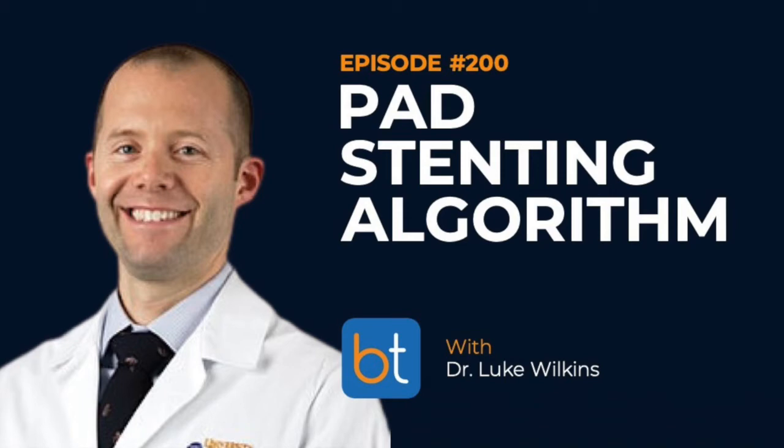Can I clarify something, Luke, real quick? So you're saying that significant disease less than 10 centimeters, if there's not any, you just do PTA. But if it's more than 10 centimeters, then we do atherectomy plus PTA. Am I reading that right? No, you're not reading that right. Sorry, that's like a double negative or double positive. If there's significant disease that's less than 10 centimeters, then do atherectomy and PTA. If not, I'll just go PTA. And if it looks good, then I'll DCB it. I see. Okay. You know what I'm saying?